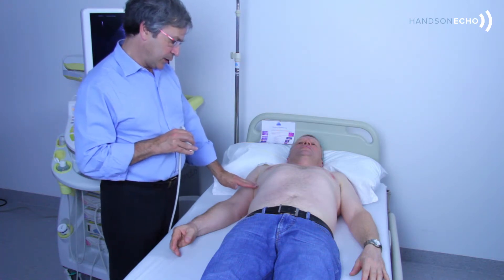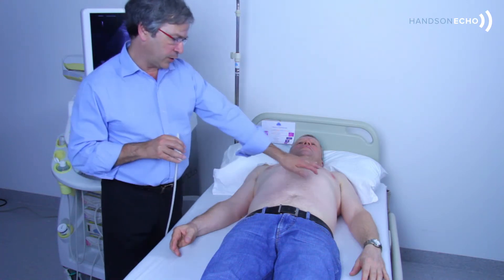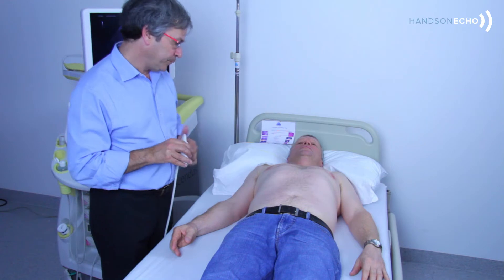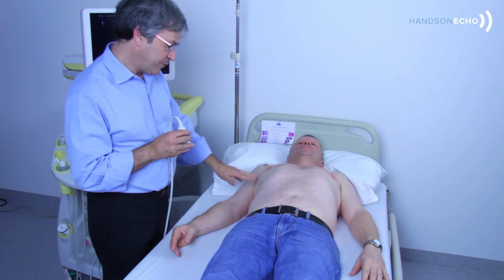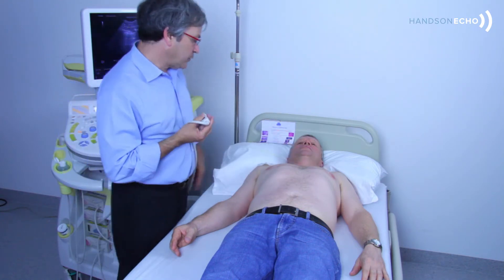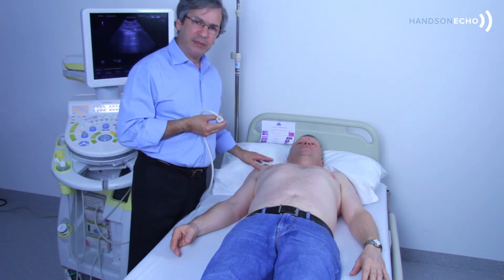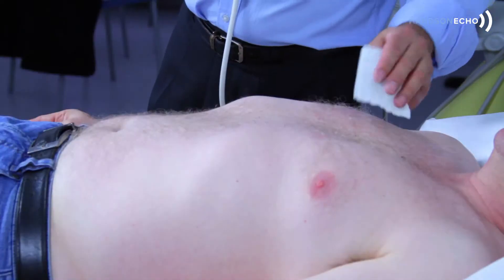Just before the liver or the spleen, and often you can see isolated B-lines anteriorly.